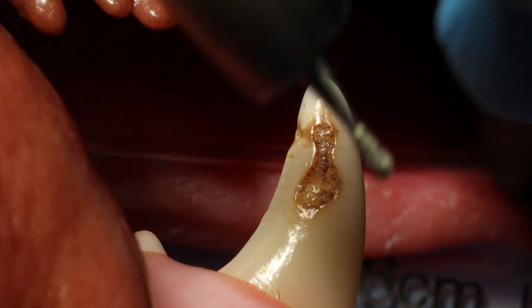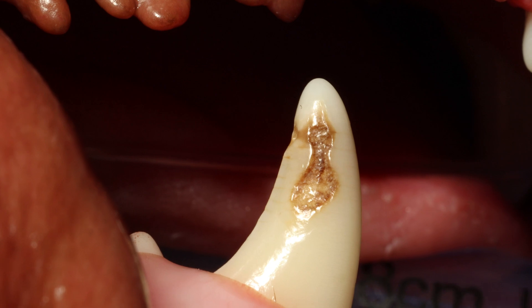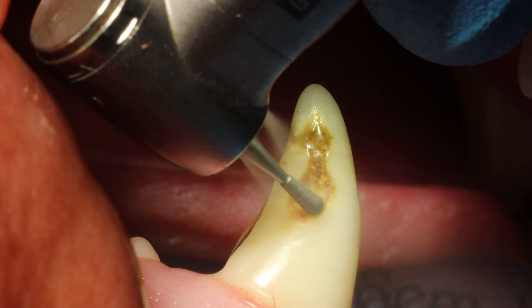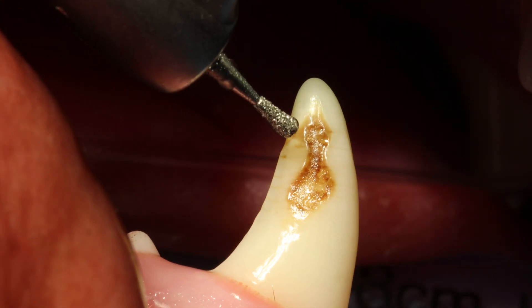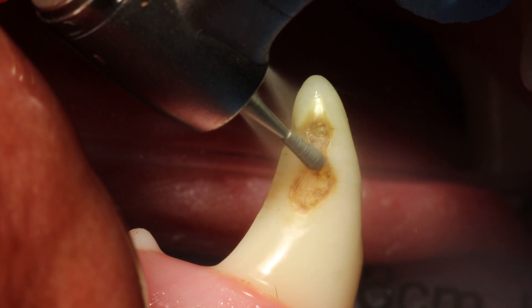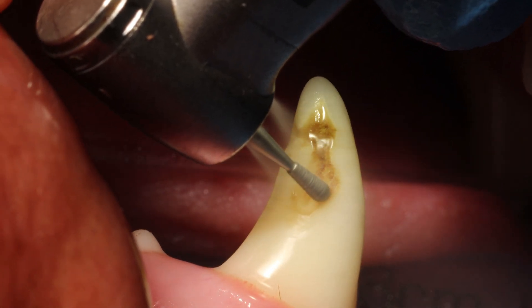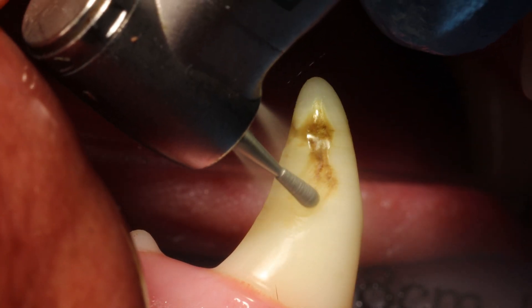This is an enamel defect of a lower canine tooth. In theory these don't always need treatment, as in most cases they have already sealed the exposed dentine tubules from within. But in this case we wanted to make the surface nice and smooth and a little bit more resilient.